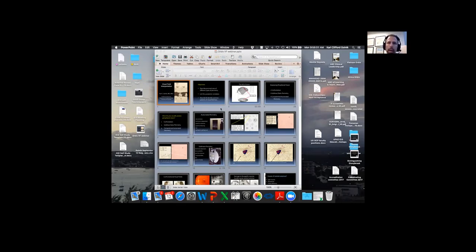The next question is, what is the best visual field test for neuro-ophthalmology? Well, that, I guess, gets to what I just said. So it depends. My routine visual field test is a 24-2 fast pack. Why? I want to get the information as quickly as I can. The longer the field test is, the more difficult it is for the patient, depending on your patient. The more time you make them do the test, the more garbage you're going to get out of it. So I like to get as much information as quickly as I can. I don't think the 30-2 gives me much more information. I'm looking for patterns, so a 24-2 fast pack is my common test.